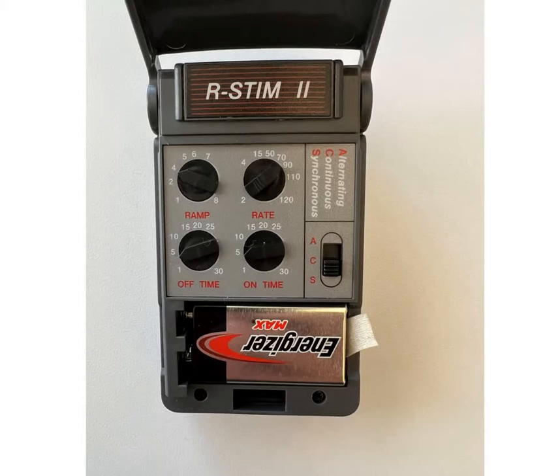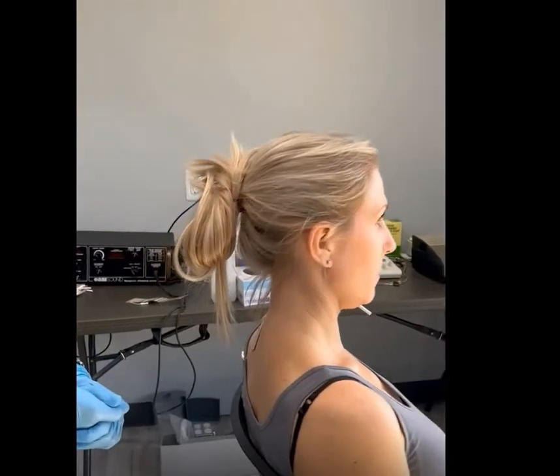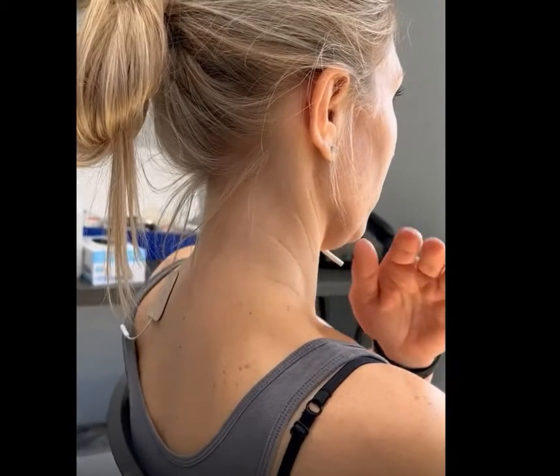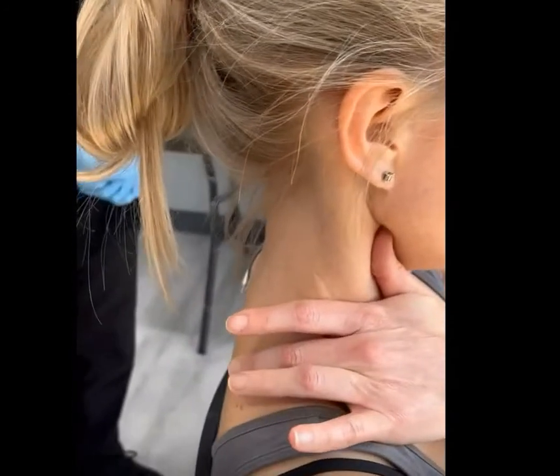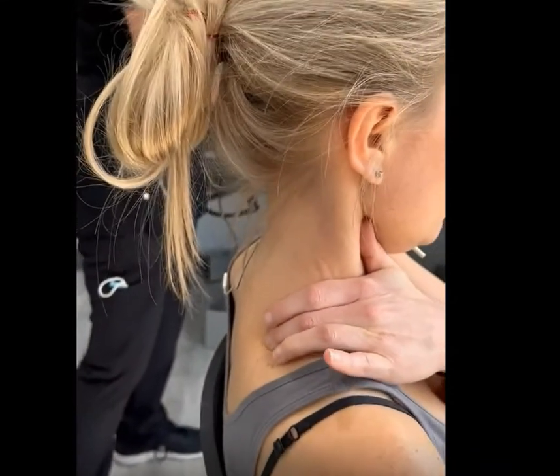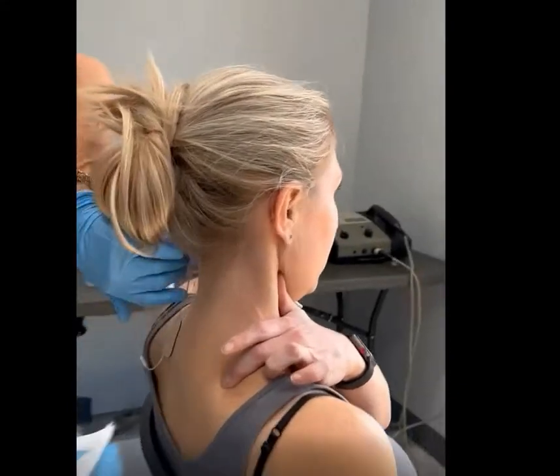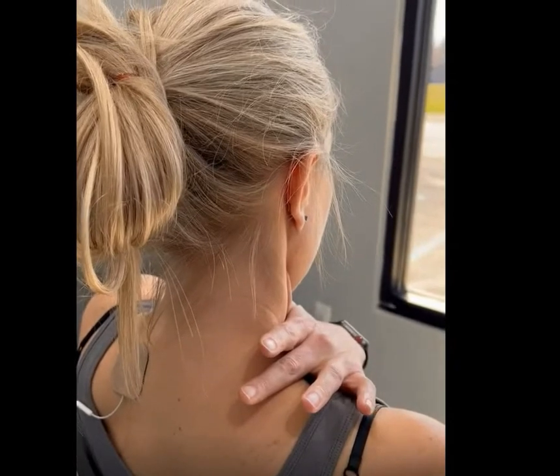Now that you understand what settings you are looking for, let's review the basic use of the NMES TENS unit to help relax the jaw and neck and shoulder muscles. You must identify the major muscles that cause dysfunction in the jaws and neck. Start by locating the trigger point of the trapezius muscle. This is done by crossing your arm without lifting it over to the other side, then taking the middle finger to locate the trapezius muscle trigger point. It is important that you find the middle of this muscle and that it is not on the bone. Clean the area with alcohol and then place a pad directly over these points.